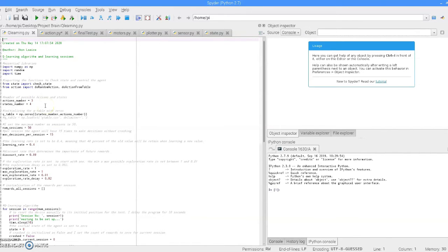First, we initialize all the variables. First the actions and the states, to then create the Q-table and initialize it with zeros, the maximum number of sessions, the maximum decisions per session, the learning rate, the discount rate, and set up the exploration rate and the exploration rate decay. Also, we initialize a list that will contain the rewards from all sessions.